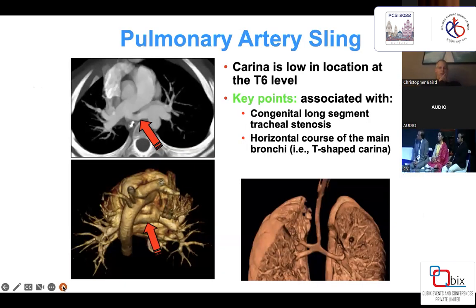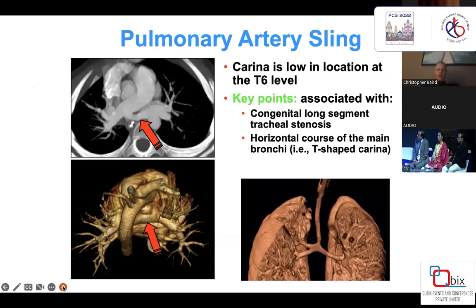Another entity: CT scan is very helpful in identifying pulmonary artery slings and the associated defects, such as complete tracheal rings and congenital long-segment tracheal stenosis.